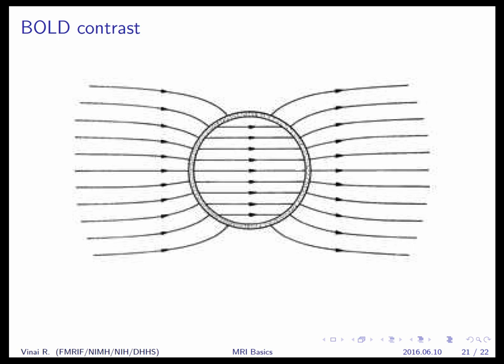If you have a very, very short TE, it doesn't give them any time to dephase, so they don't really destructively add. And so that signal, the veins will be high, the tissue will be high. But when TE gets longer, the vein signal will be low and the tissue will be less low. So that's why the veins look like these dark dots in a long TE T2 star image.